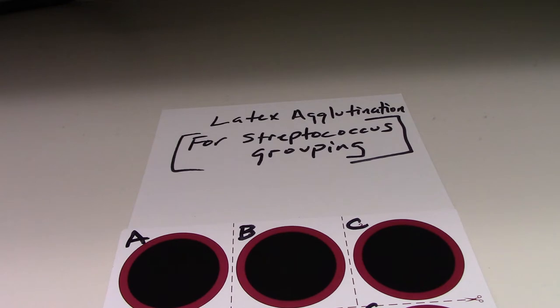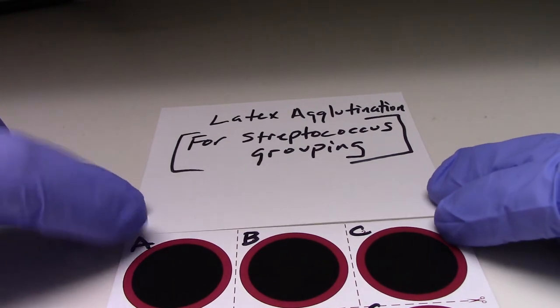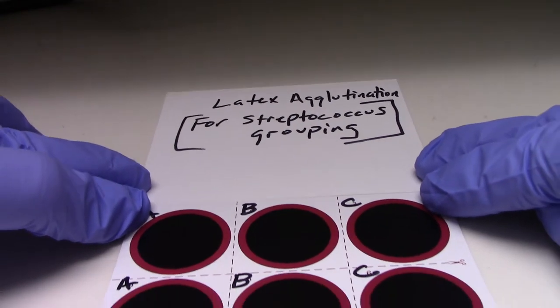Strep B, a lot of times I tell students B is for babies. That's something that you'll have to include on your report on why it's important to find group B in babies.